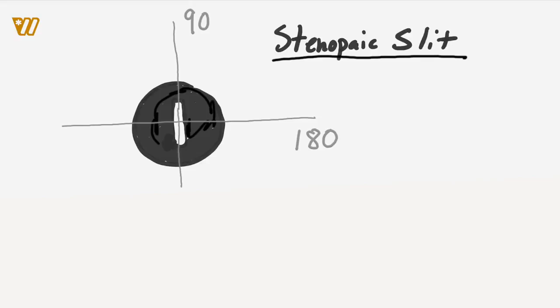The other key point is, whenever we're using a stenopeic slit, how do I know whether somebody is just a spherical patient or they've got astigmatism? Whenever you put the slit in front of the patient, either vertically or horizontally, you say, look at some point in space. You can do this one eye at a time. You rotate the slit all the way around, and if they say the world never gets more clear, never gets more blurry, that's a spherical patient. You take the stenopeic slit away, and now you trial lens them to figure out the best sphere to correct for this patient.